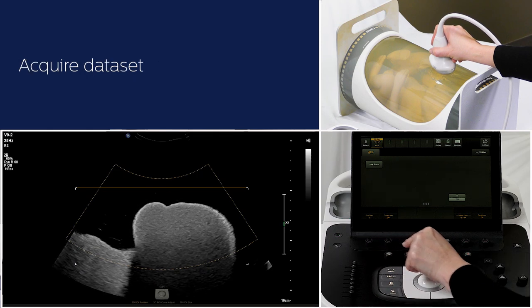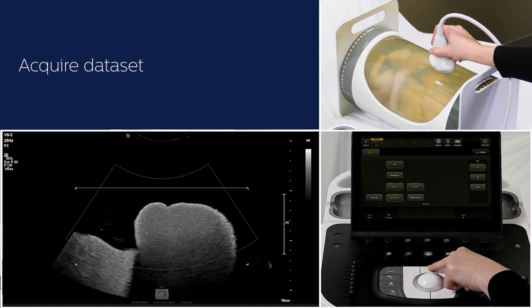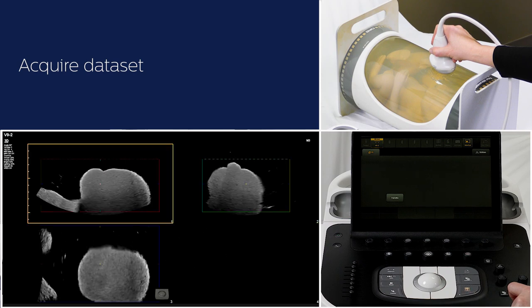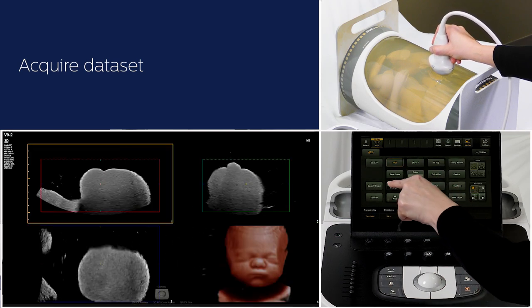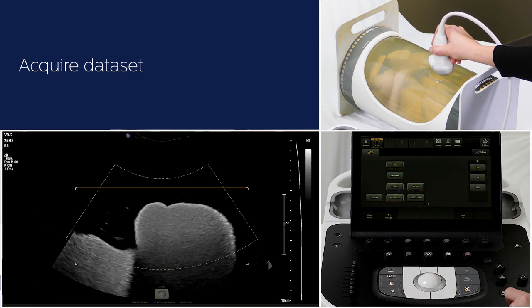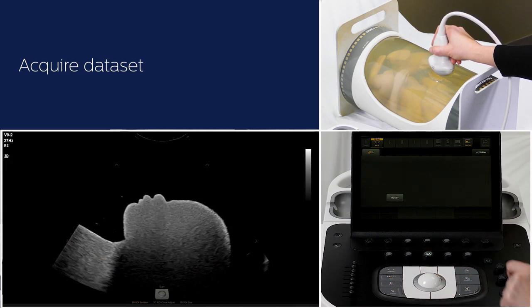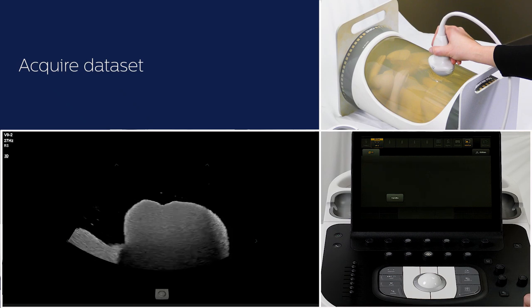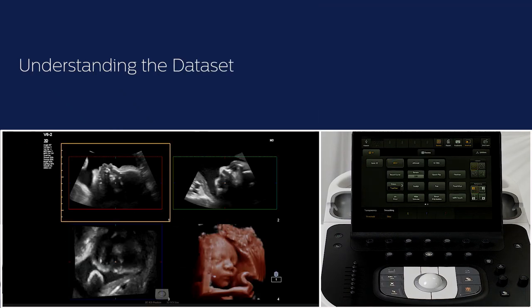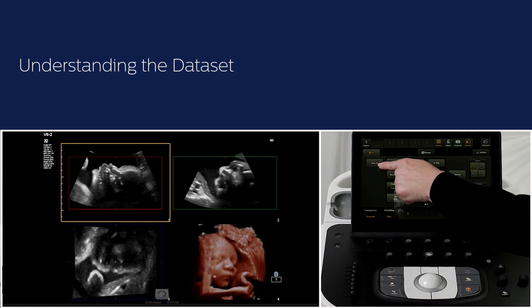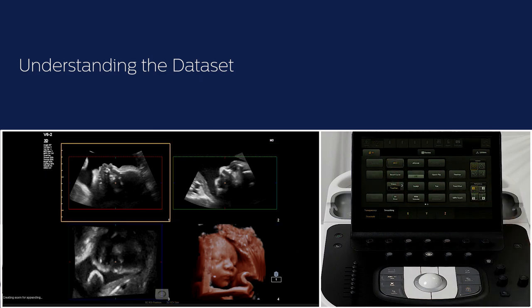Press start 3D on the touchscreen or the middle button above the trackball. Press stand by on the touchscreen or the middle button above the trackball if you want to reacquire the data set. On the monitor you see the sagittal, transverse and coronal plane of the fetal face as well as the volume image numbered from 1 to 4. To manipulate the data set at a later time, press save 3D on the touchscreen.